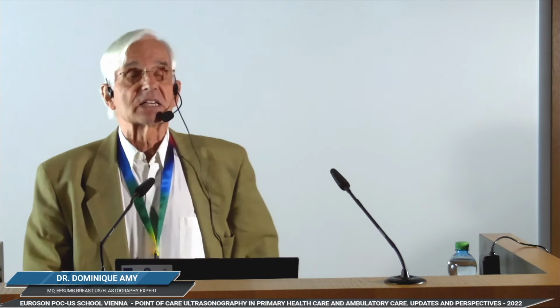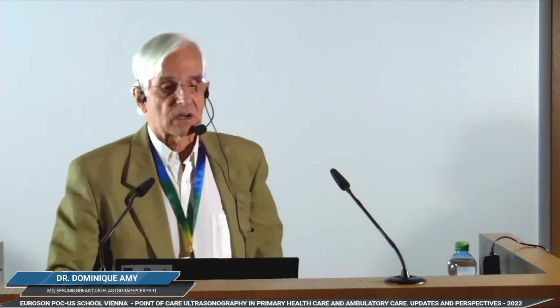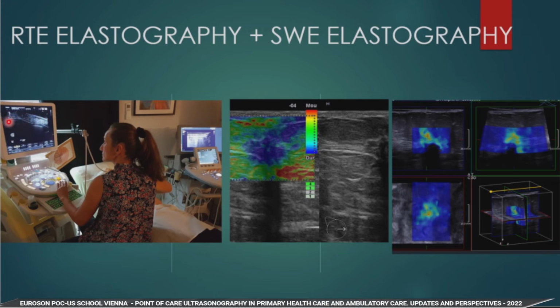I had the chance to work with the pioneer of strain elastography from Hitachi, and here the shear elastography from SuperSonic Imaging, which is now the Hologic company.